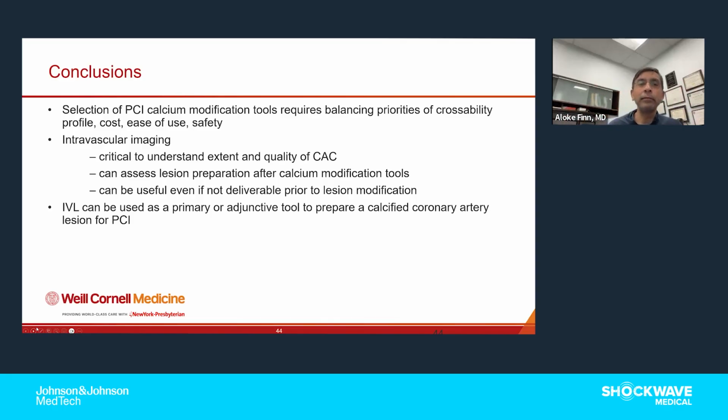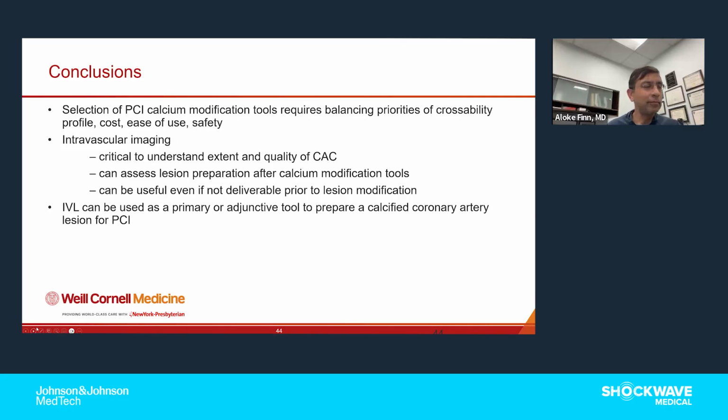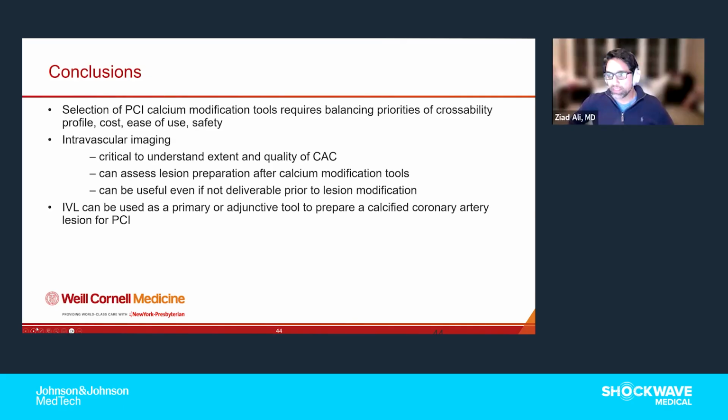Ed, you want to add something to that? Yeah, I mean, we really designed these two studies to be clinically relevant because you asked a very clinically relevant question. Hey, Z, on intravascular imaging, how do I know when I'm done? Before Alok and I presented the data at PCR, I think 2 years ago, nobody realized that OCT missed fractures. Everybody thought it was the gold standard.